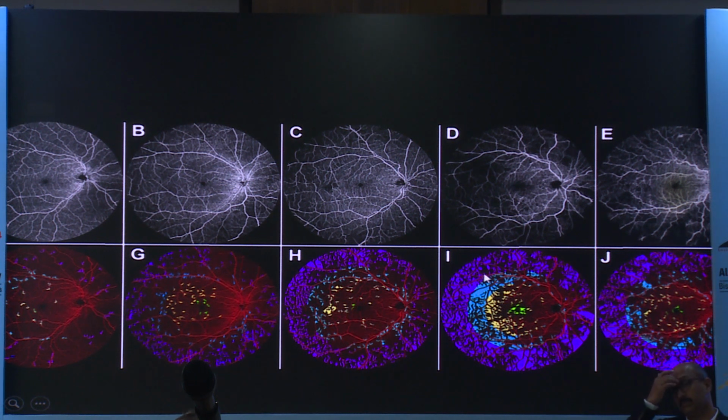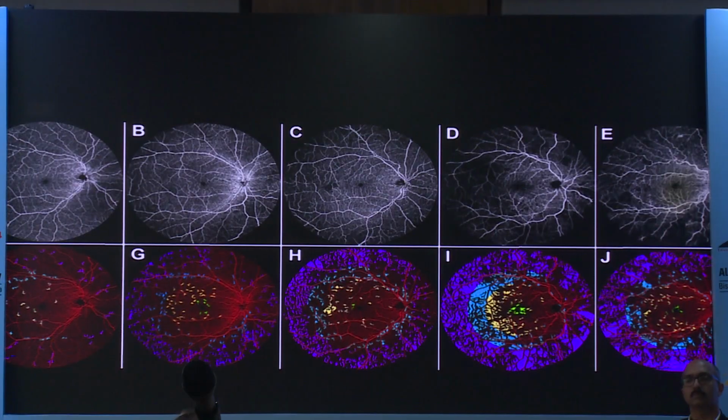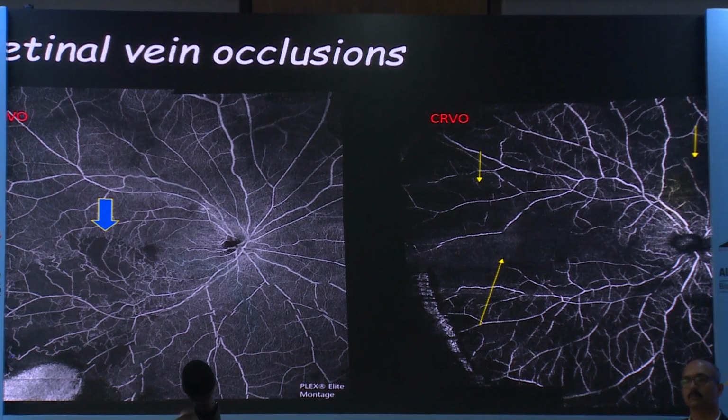A patient who is on spectrum J rather than F, we would call for more frequent follow-up. I think Dr. Shane also mentioned that the follow-up becomes much more frequent because these are more likely to go into PDR and require laser much sooner than somebody on the spectrum of G and H. So they've actually quantified it and shown on OCTA how this is important.